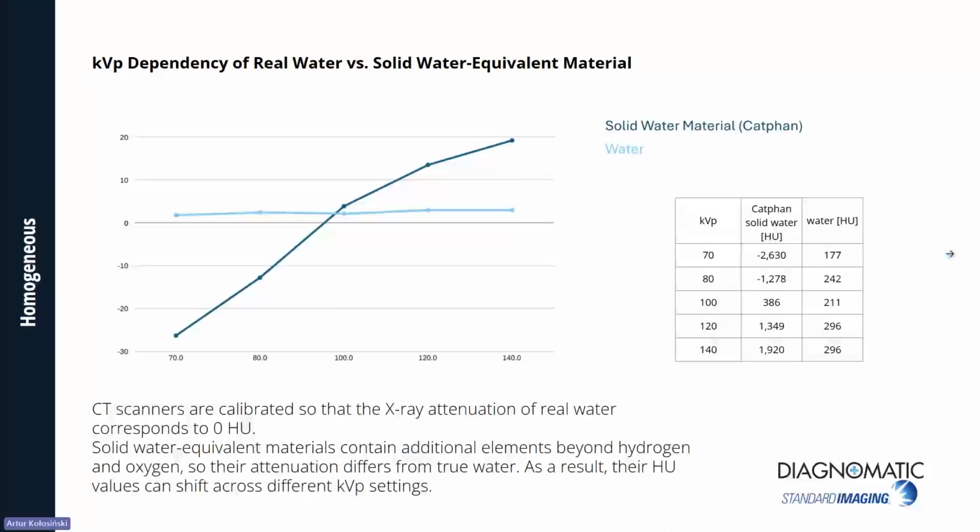And when I was talking about the real water, I think medical physicists prefer the real water because regarding the energies, it always has the same value. Regarding the solid water, the HU value depends on the kilovolts: at low energies we have a different HU, and when we increase the energy, it also changes.